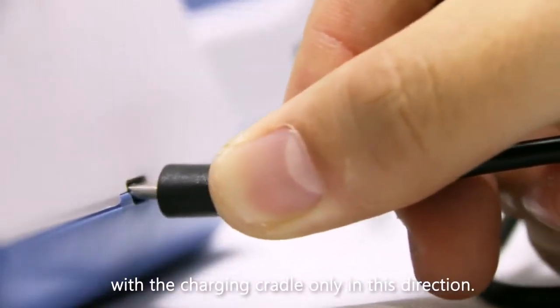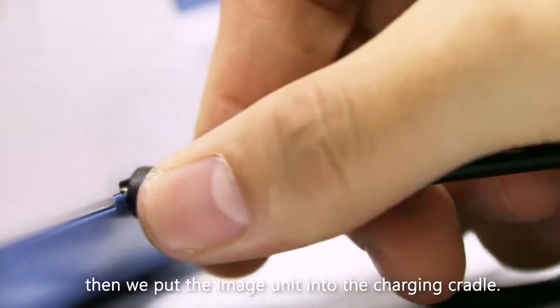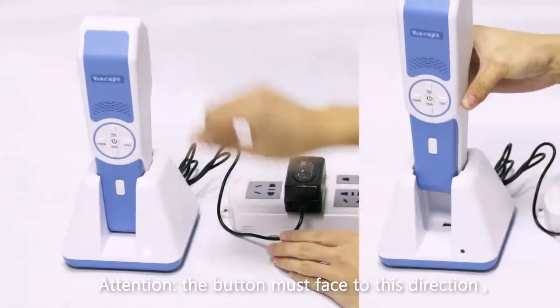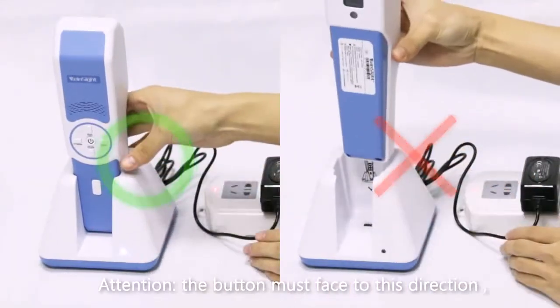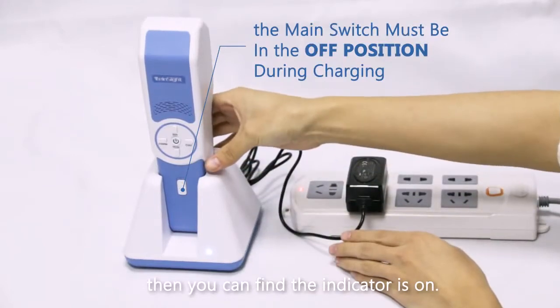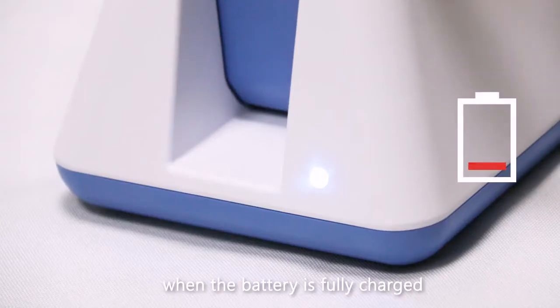Attention: we must connect the charging cable with the charging cradle only in this direction. Then we put the imaging unit into the charging cradle. Attention: the button must face in this direction. Then you can find the indicator is on.